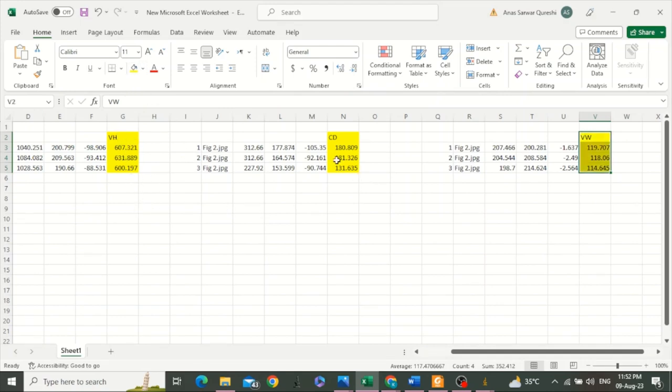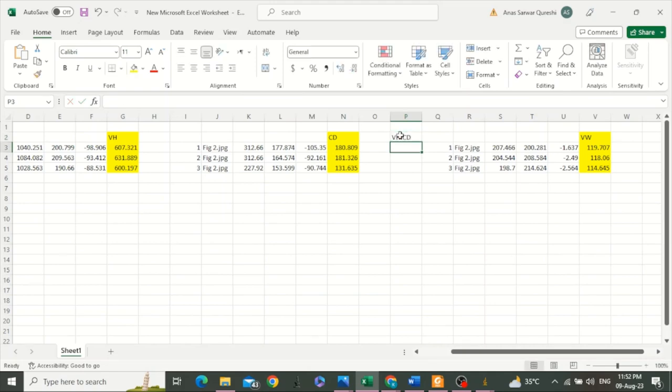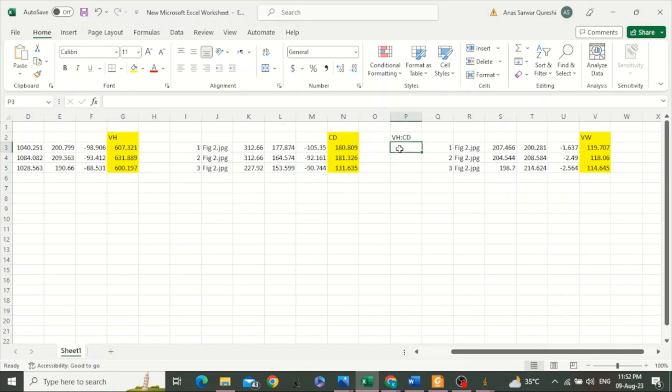The next thing is to calculate a ratio between villus height and crypt depth. This ratio is obtained by dividing these values with these values.